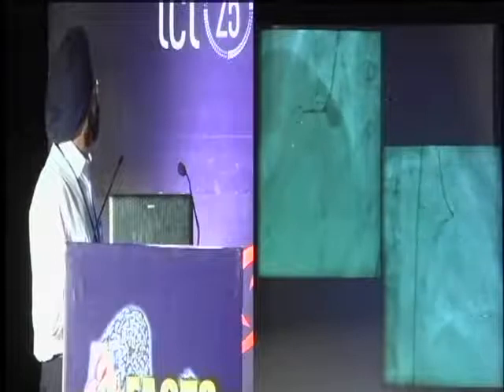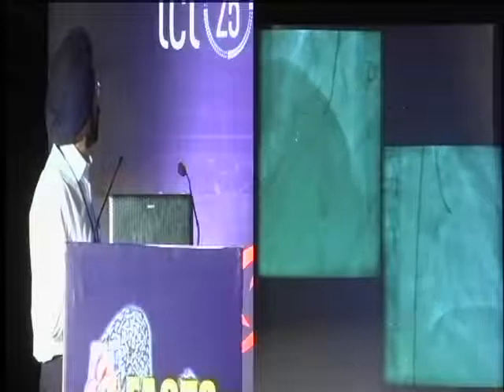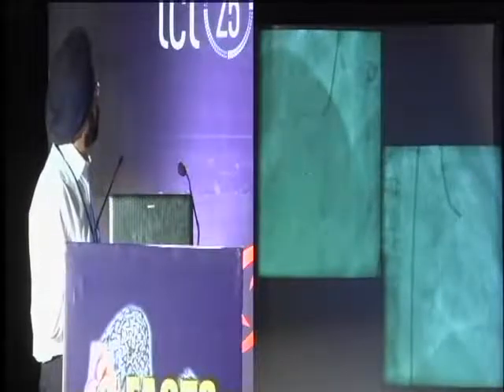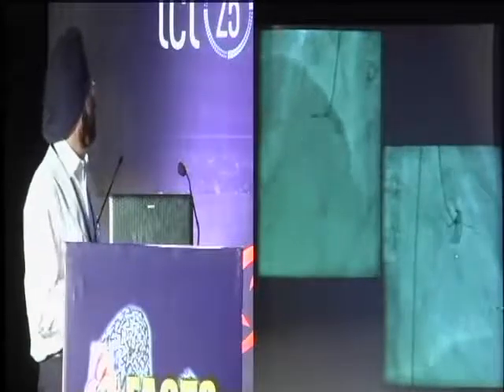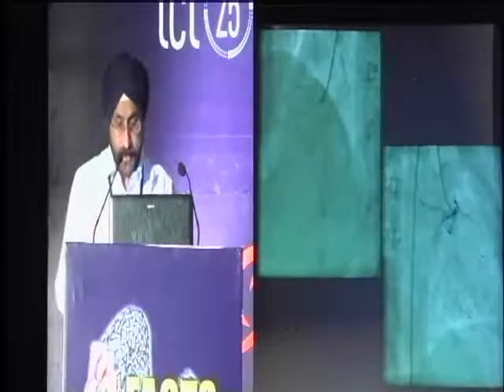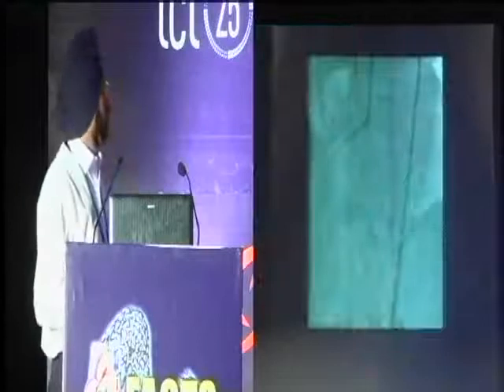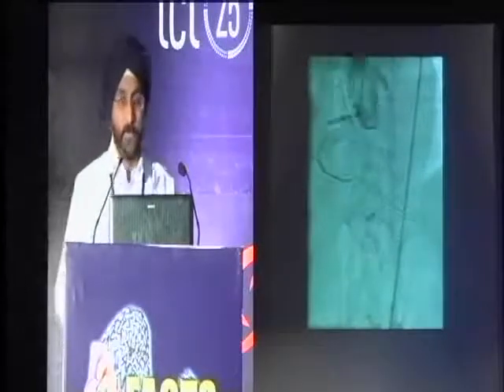In this LAO view, you can see that this wire has actually gone out, but the good point was that it was still catching some branch, most likely an RV branch. So subsequently, we always check in 2 different views, and in the other view the wire was repositioned into the RCA. Then the problem came about the balloon. Since it was a CTO, no balloon was going into it. So we took a 1.25 millimeter balloon, created a channel, followed by a 2.5 millimeter balloon. We were very happy that the result was very good, but this is what we landed up with later on.